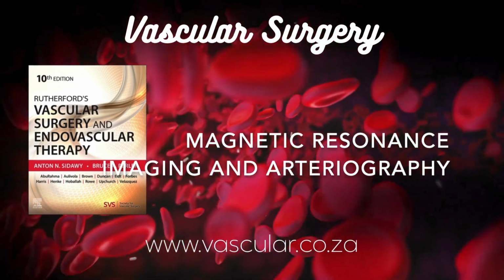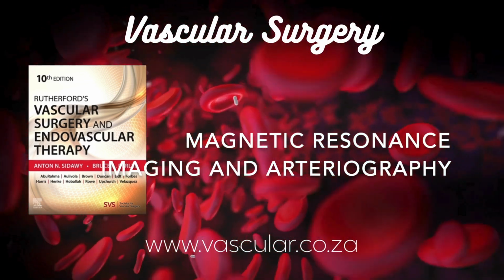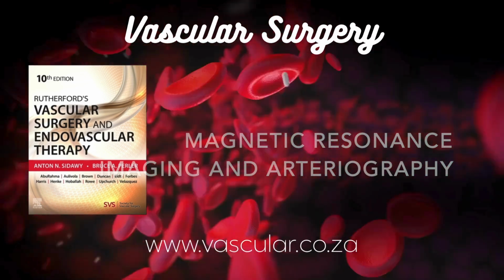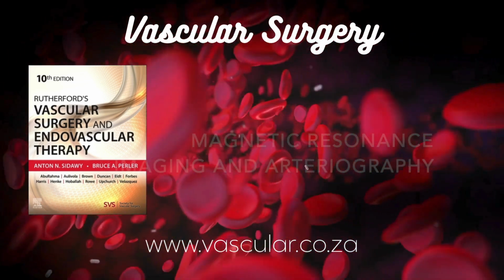MRA is also great after interventions like bypass grafts or stents to check if they're still open, look for new narrowings, or spot complications like pseudoaneurysms. There are even studies showing MRA can sometimes see more vessels in the foot than DSA can. Impressive. Okay, how about the kidneys?